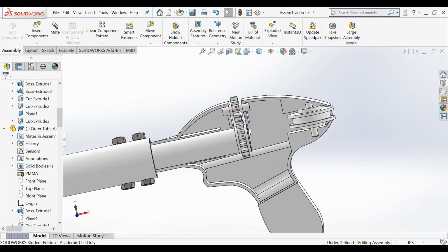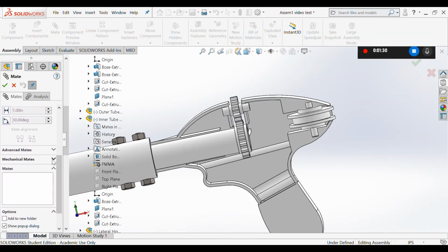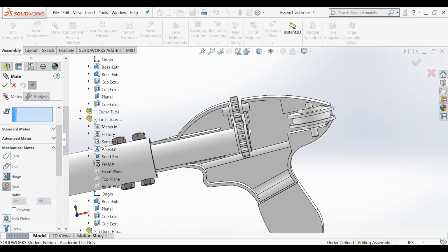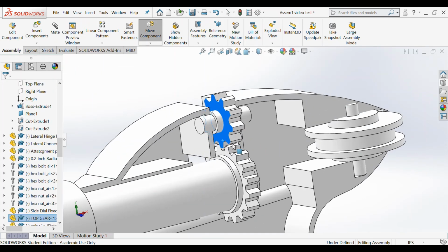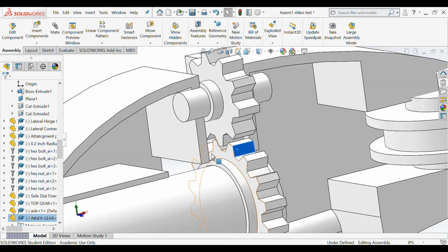Next, I'm going to put a gear mate between this gear and this gear, which will allow this gear to move this gear, which will in turn move the entire rod connector piece. So we're going to go to mate. We're going to go down to mechanical mates, and we're going to choose gear. Now first, before doing such mate, we're going to go on ahead and zoom in, and I want to align the teeth of our gear so that there is no interference.